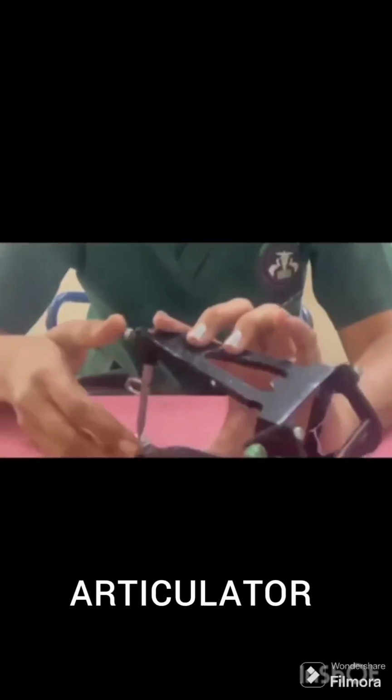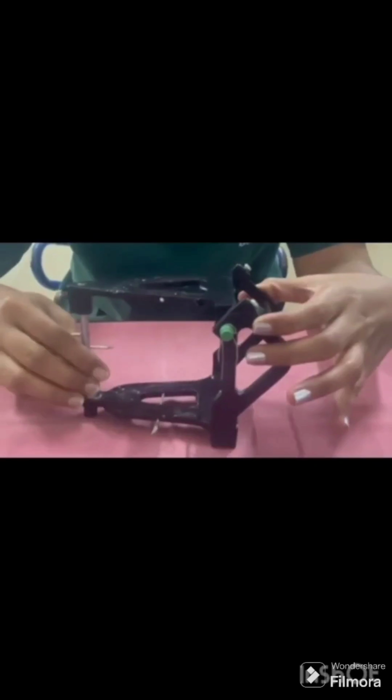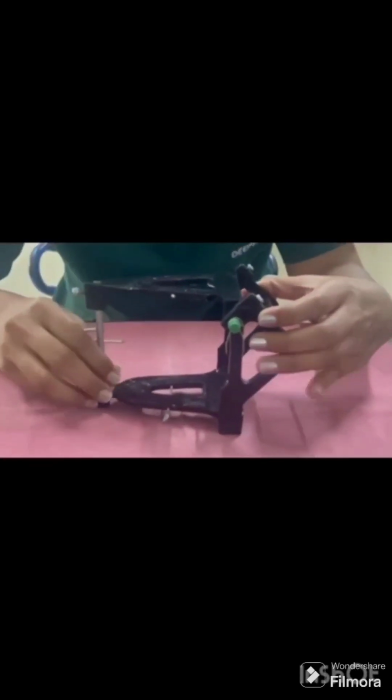Coming to the articulators, what is the definition? The definition is a mechanical device which represents the temporomandibular joint and the jaw members to which maxillary and mandibular casts are attached to simulate the jaw movements.